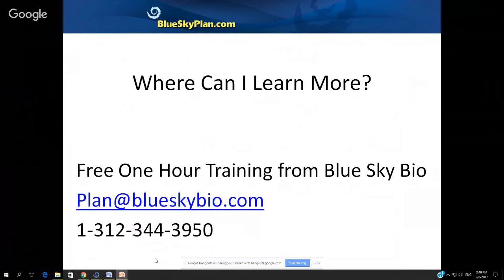Where can I learn more? So we have a lot of different avenues and ways that you could learn more about Blue Sky Plan and guided surgery and implant placement. Blue Sky Bio offers a free 1-hour remote training. You could set that up by emailing us or calling as well.